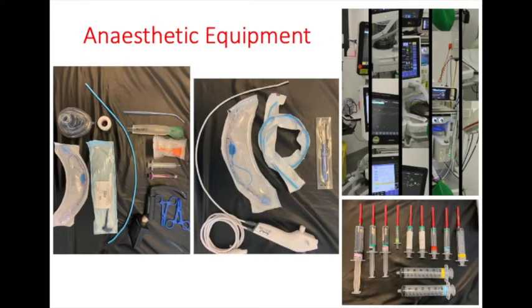The anaesthetic team should also identify appropriate equipment, including the necessary drugs in sufficient dosages to cover the duration of the procedure. This includes sufficient muscle relaxant in patients who may consume large amounts of this to achieve surgical level anaesthesia. Appropriate tracheostomy tubes, filters, and reintubation equipment should be prepared. There are more details on this later in the presentation.